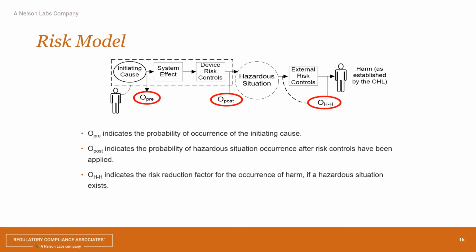So if I have, for example, a diagnostics piece of SaMD, it's all about my false positives and false negatives and what happens if I do those things, and then what does the clinician do? For example, if I have a hematology instrument, which is something that I worked on, if I look at my hemoglobin and it's wrong, and it's 8, for example, and I look at my RBC that is 5, the clinician would never do a transfusion because they know 3 times RBC is plus or minus 20% of HGB.